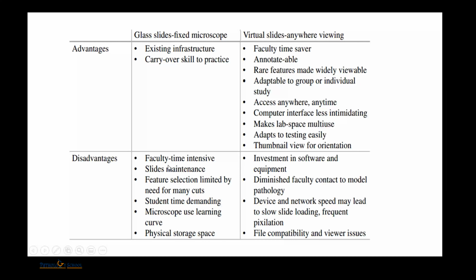Disadvantages of glass slides: it is more faculty time intensive. Everyone has to come to the department and view all the slides through traditional microscopes. Your slides and slide papers have to be maintained and kept in order. Then it is student time demanding. There's a microscope learning curve for everybody, and physical storage is a main issue with traditional glass slides.